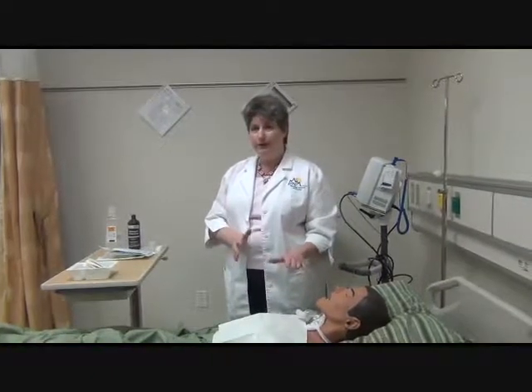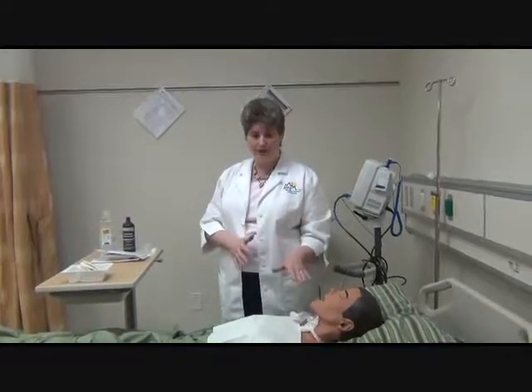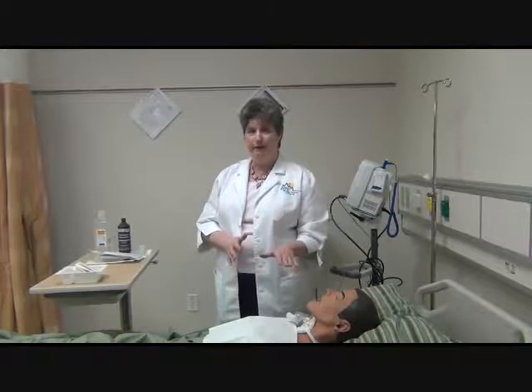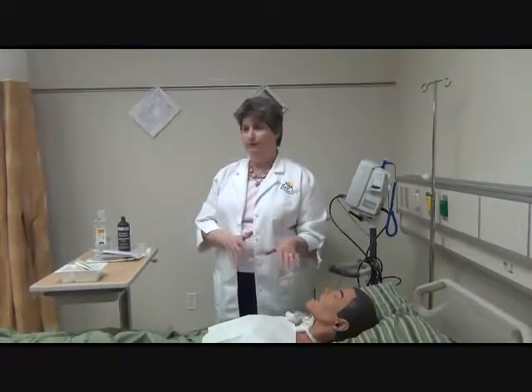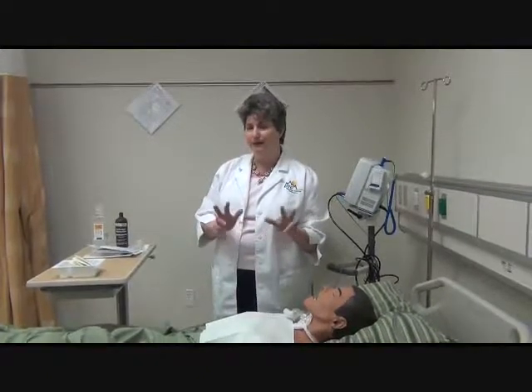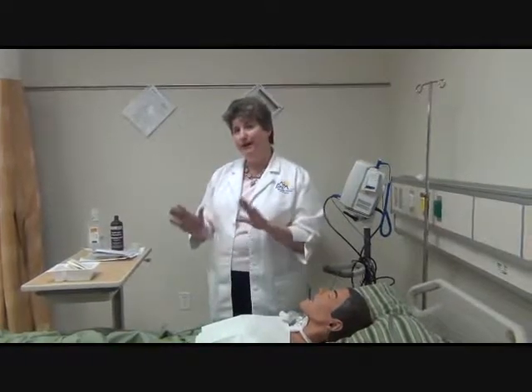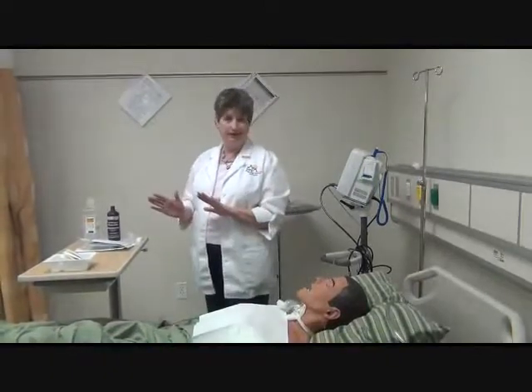So I want to do everything I can to assure that I don't provide infection to the patient. When I touch the patient or I have any kind of bacterial contamination, it's already going to be his germs. So again, while it's not technically sterile, I'm going to try to keep it clean, and when I can, I'm implementing sterile technique. It's just as easy as it is to do it clean.